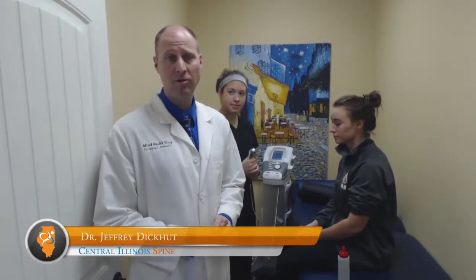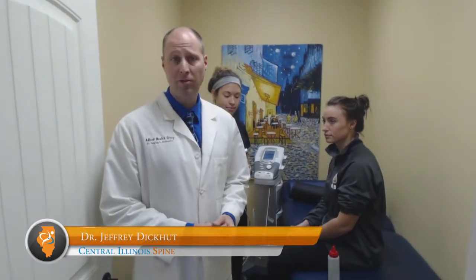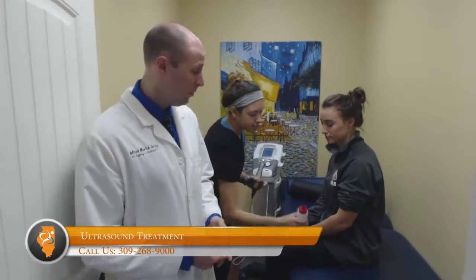Another treatment that we have is ultrasound. Ultrasound uses sound waves to create heat in the tissue, which brings in blood flow, can help break up adhesions, and aids in the healing process. Today, what we're going to do is treat lateral epicondylitis, or what's commonly known as tennis elbow, with the ultrasound.